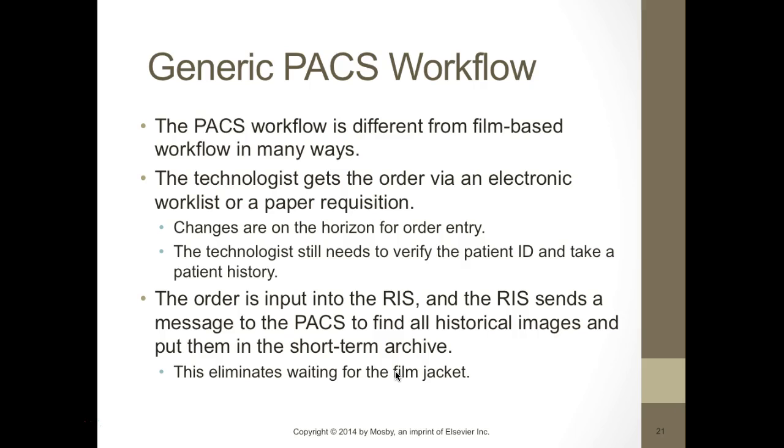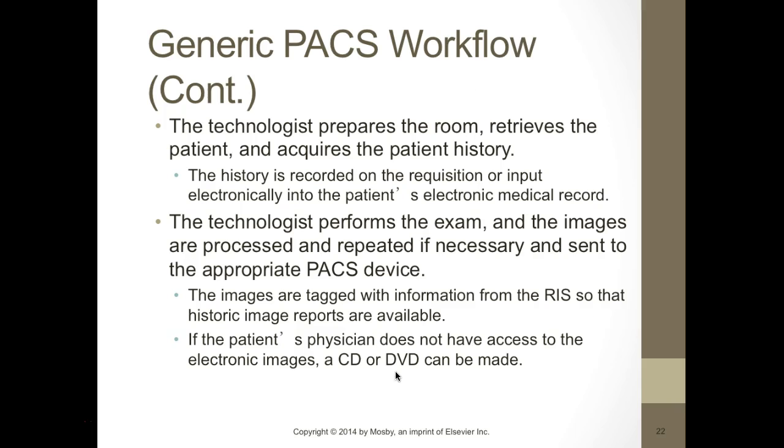So whether it's in short-term or long-term archives, this eliminates the waiting of a film jacket, which is great. So the tech still prepares the room, retrieves the patient, acquires the patient history. So you still need to record it. You're going to record it in the comments section, or if you are on Epic or a different kind of medical record, you can log it within the patient's record.